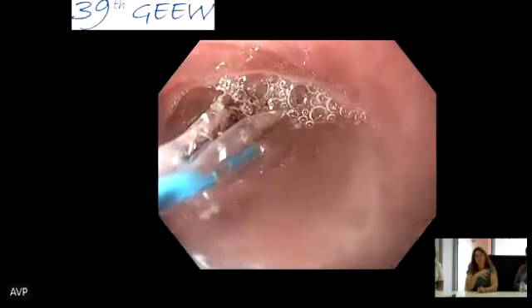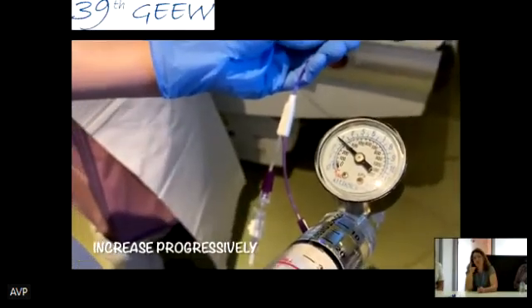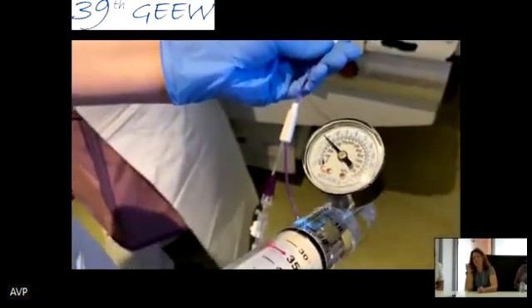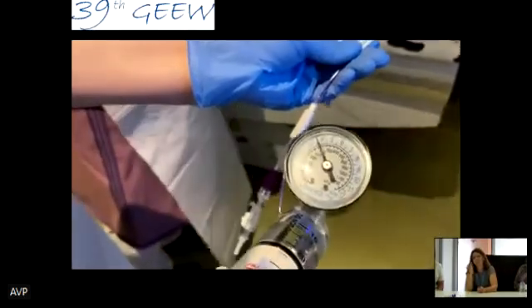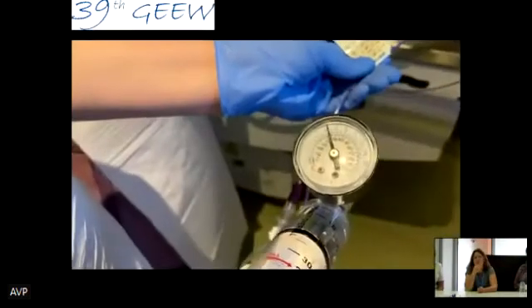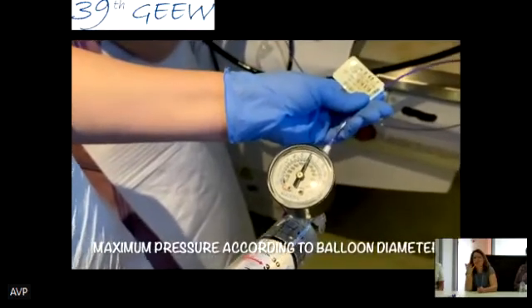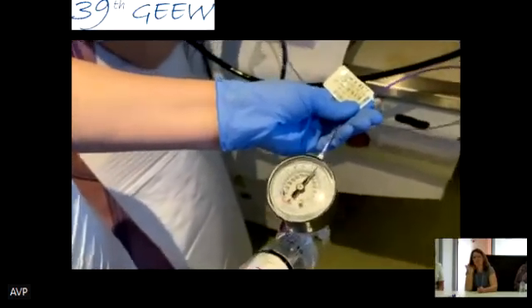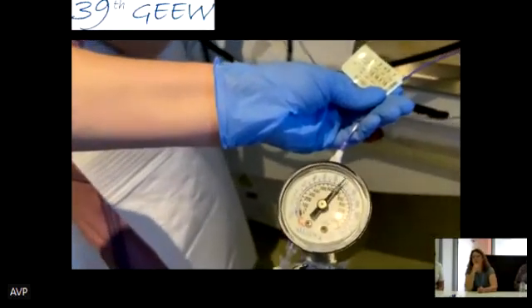And here we're going to also see if there's stability in the needle. If you're still dilating with your pressure, your needle will go down every time, so you have to put again some pressure. When we reach the maximum, we will ask, is your needle stable? No, it's still dilating, so we still wait.